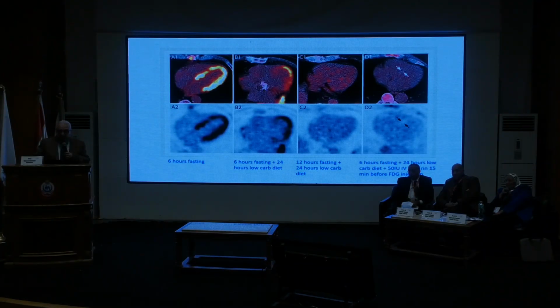These images tell you how good preparation will affect the image. The first one is normal, only 6 hours fasting. The second one is 6 hours fasting plus change in diet, and then 12-hour fasting with diet, and the last one is 6 hours fasting and 24 hours change of diet and heparin injection.